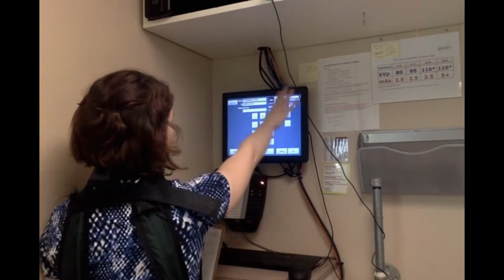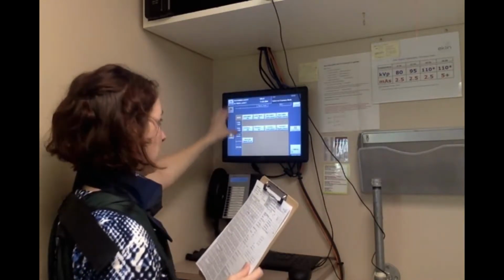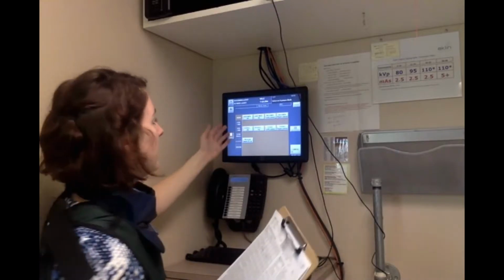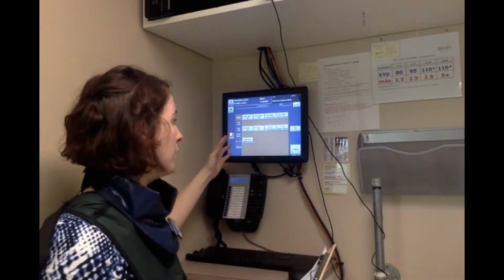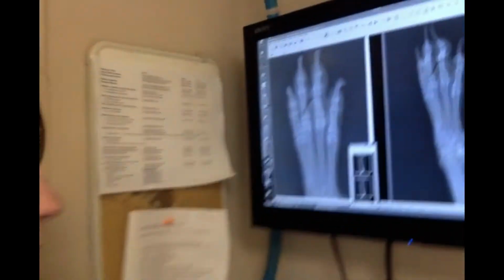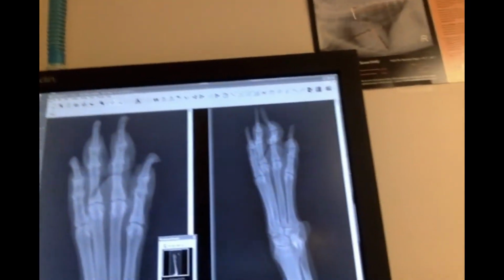And now all of this information is automatically going to print out on a digital label that it'll put in the corner of each x-ray for us. And then I can select after we take the images where that information is so that it's not in the way and we still get a nice diagnostic image. Alright, so now that I've demonstrated how to put Mr. Lucky Gossman into the system and sent the x-rays over and taken them, I'm going to show you how we retrieve them to view them out here.